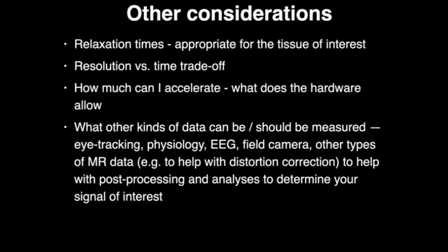And then the final thing folks should think about is what other data you need to collect to answer the questions that you're asking. One thing that our facility has become very good at and set up to do is that we have a lot of standard additional equipment to collect eye tracking data. You can collect physiology data.